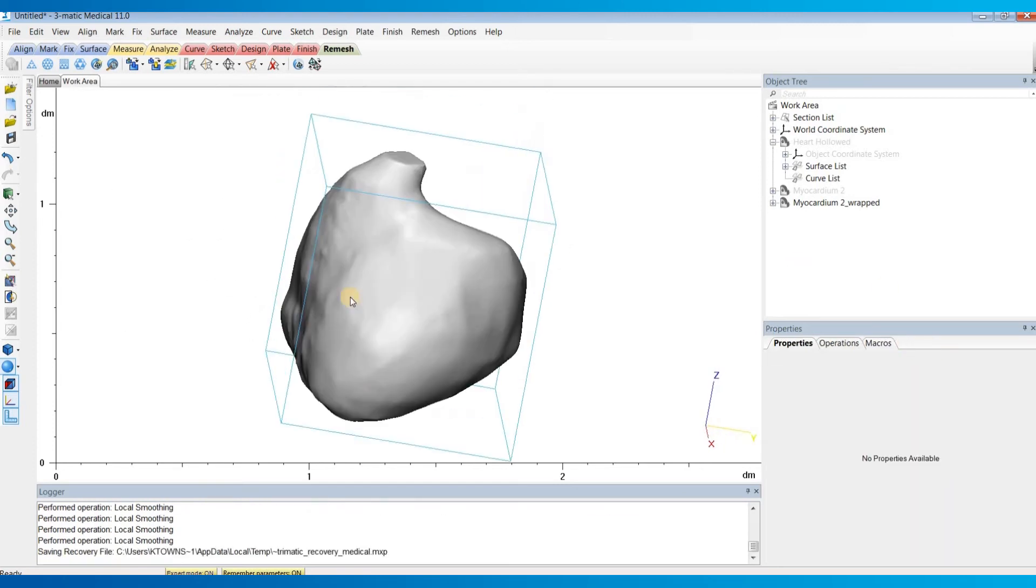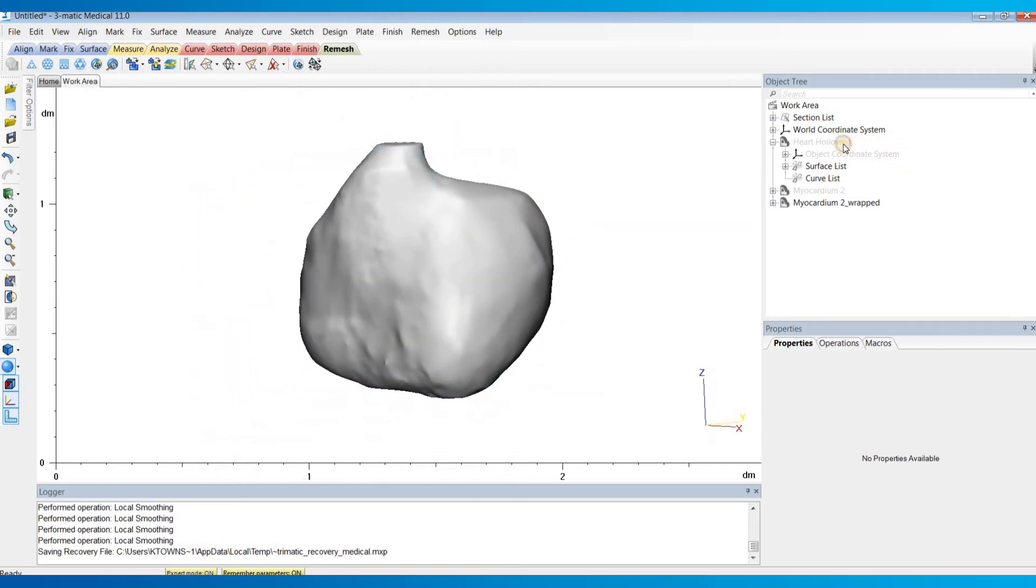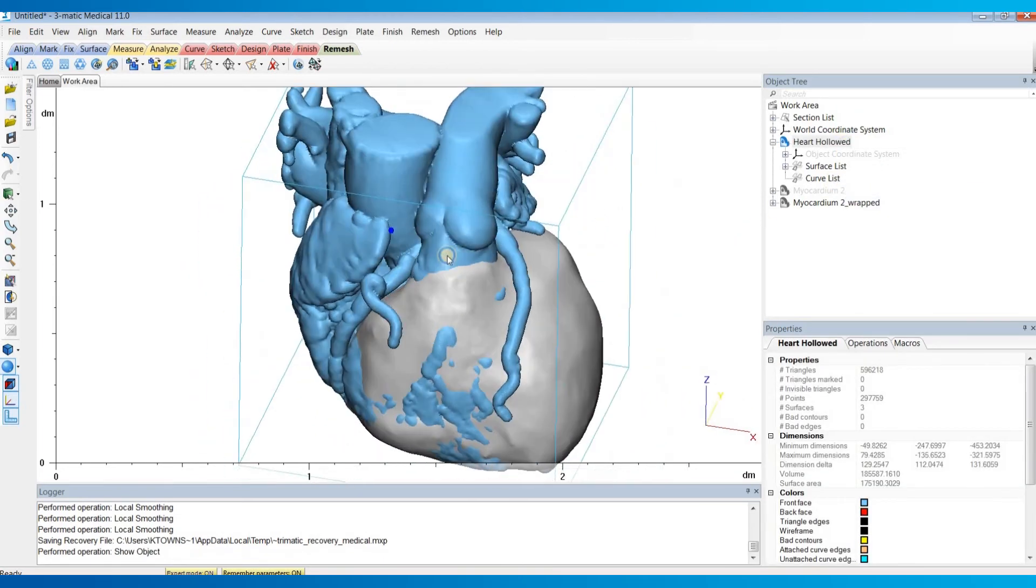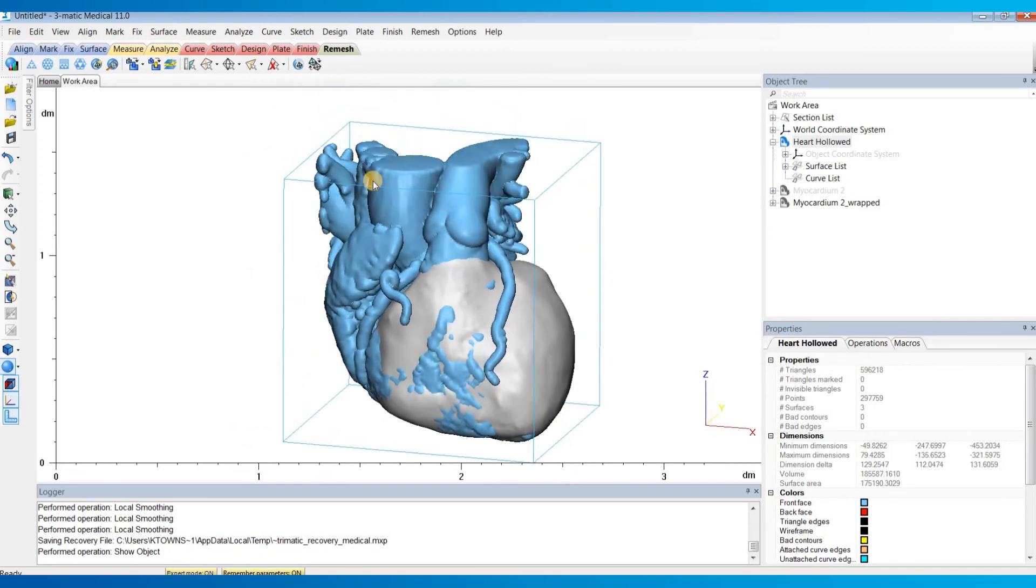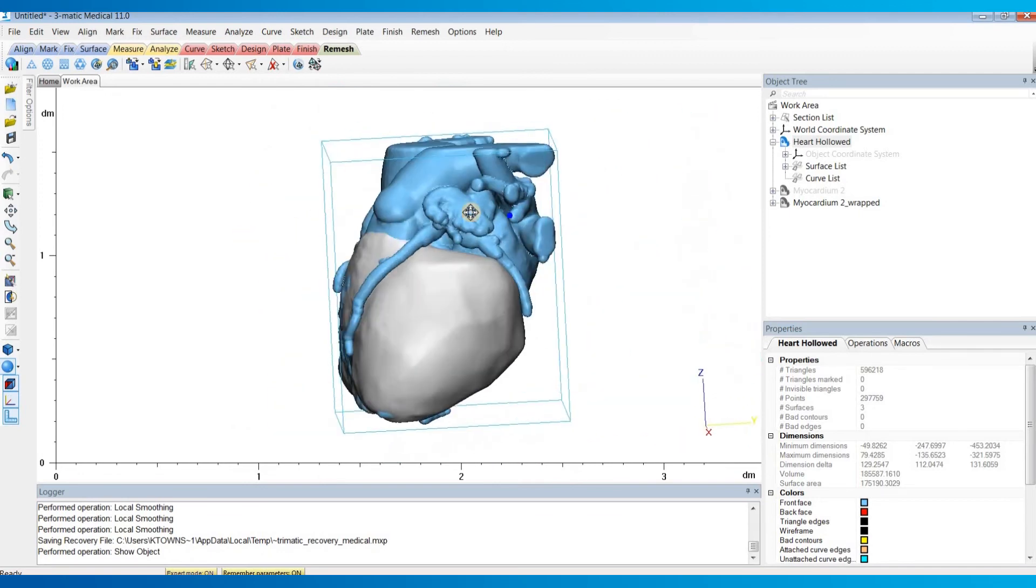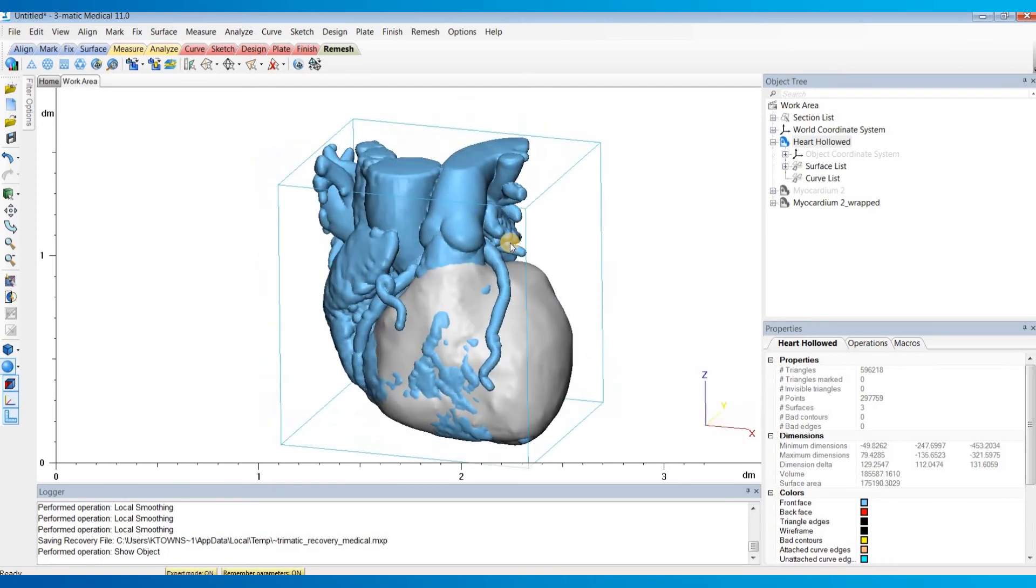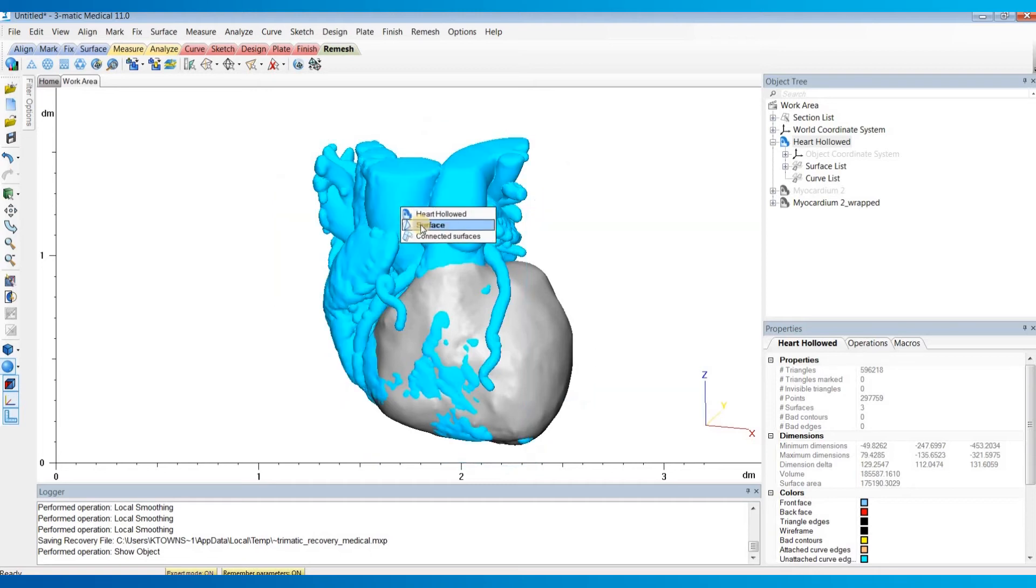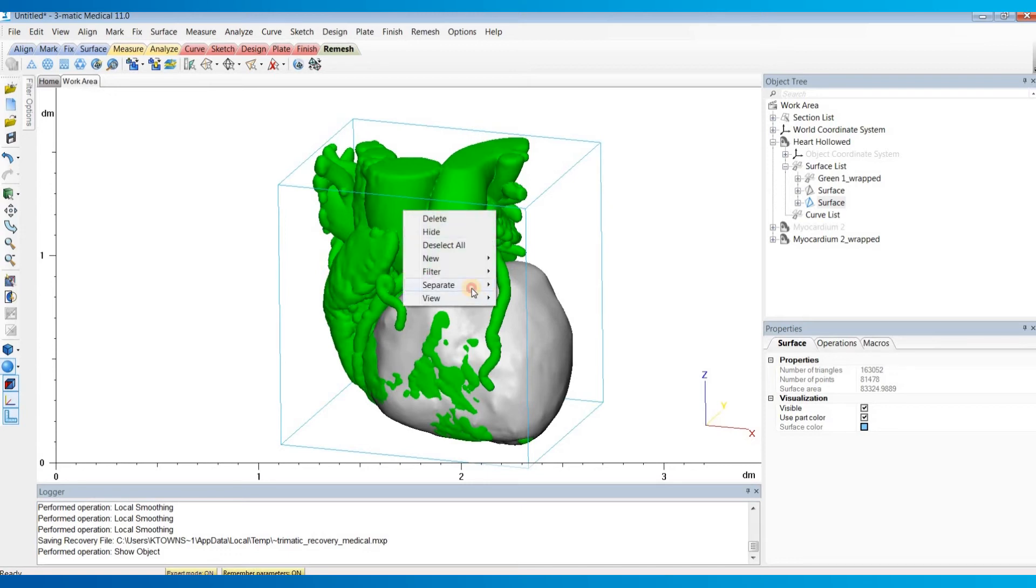Once you have your smooth myocardium and your hollowed heart model, note that I didn't cut open the hollowed heart model after hollowing it, and that's important in order for this workflow to work properly. The next step is I'm going to left click on the outside surface of this hollowed heart model and select that surface. I am then going to right click and separate it and move it to a new part.